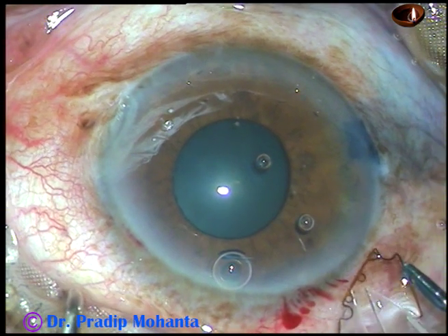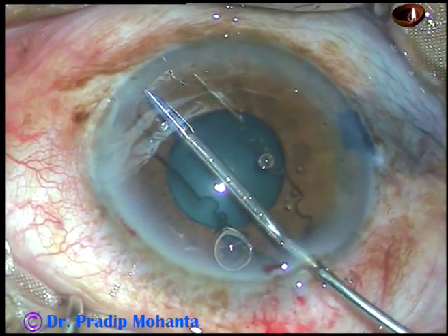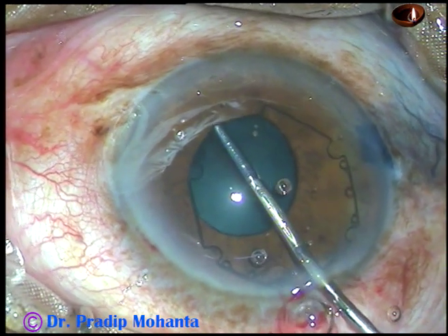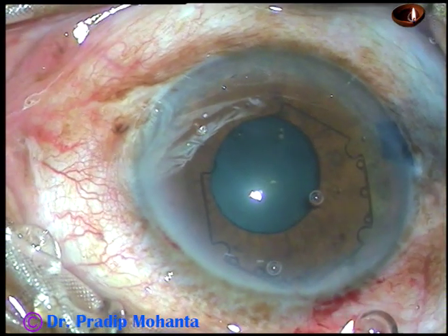The B-hex forceps is being used for applying this device. It is taken totally into the anterior chamber. The trailing part should not be stuck in the wound — the main wound — and as it goes completely into the anterior chamber, the leading flange can be tucked at once.